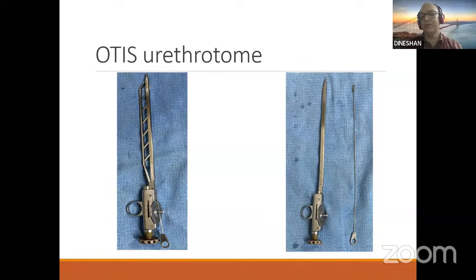I don't know whether anybody has seen them; the junior consultants and postgraduates may not have seen filiform dilators, which help to negotiate a small narrow urethra with strictures.